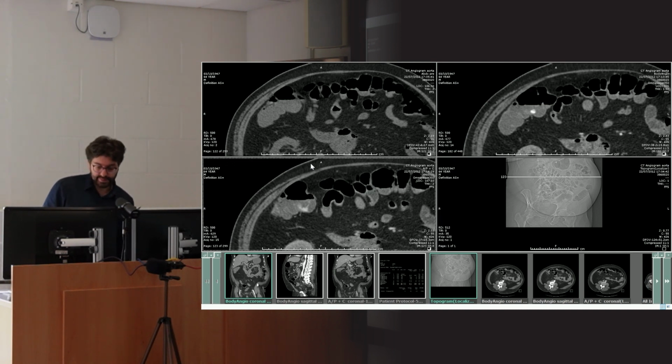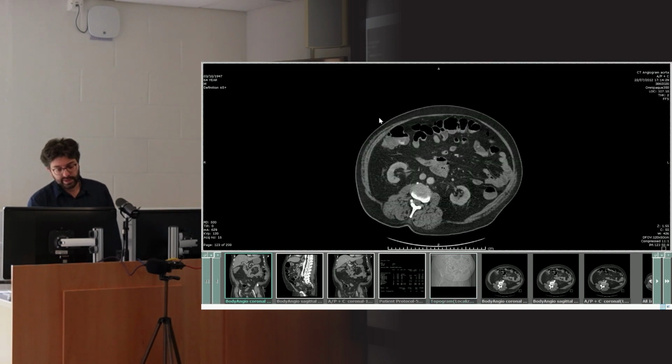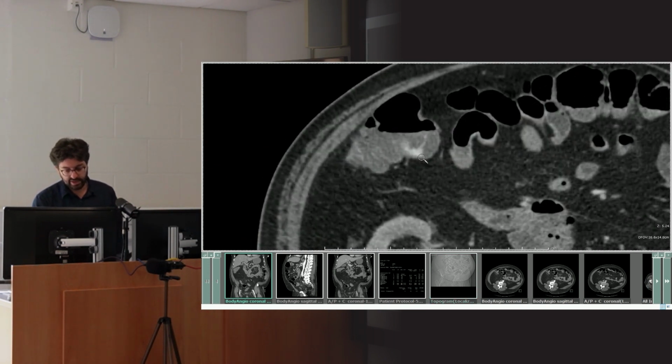The next question is going to be, well, what's caused it? As a radiologist, one of the things that's most fun is trying to delve a bit deeper. So why is this patient bleeding? What are the things that can cause bleeding? So we can look for various causes. What are the common causes that cause bleeding?